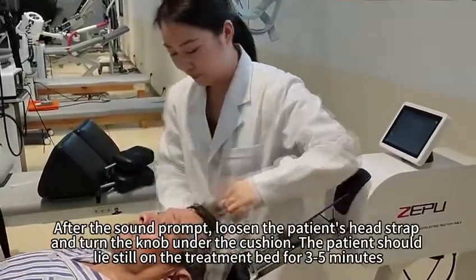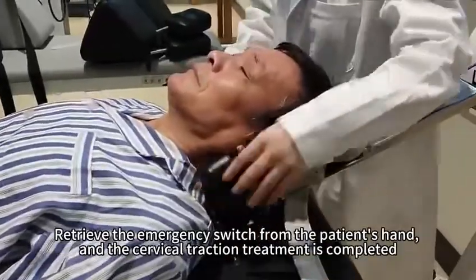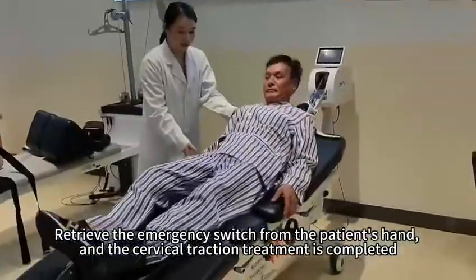The patient should lie still on the treatment bed for 3 to 5 minutes. Retrieve the emergency switch from the patient's hand, and the cervical traction treatment is completed.